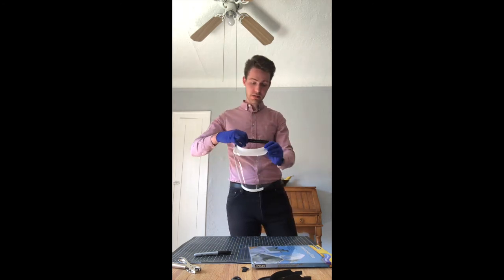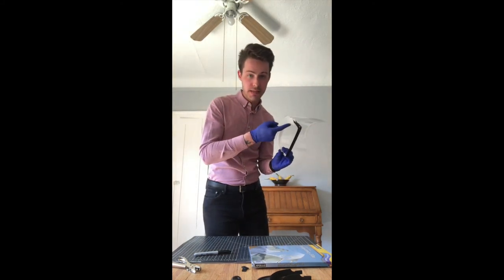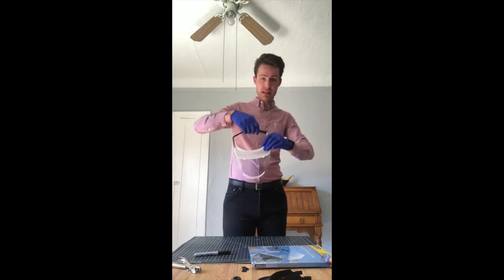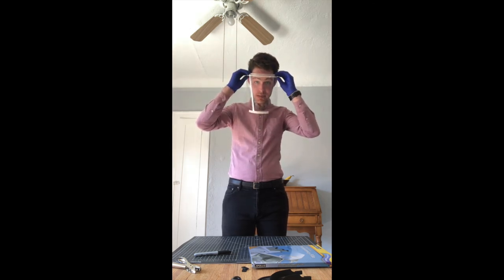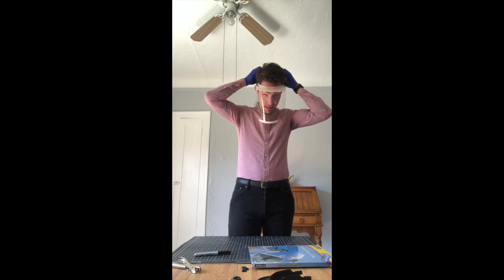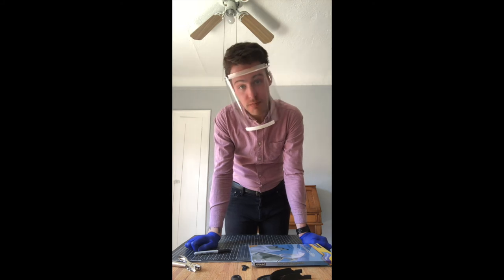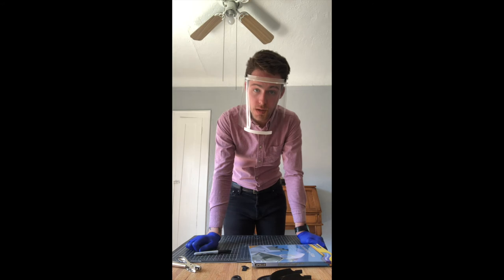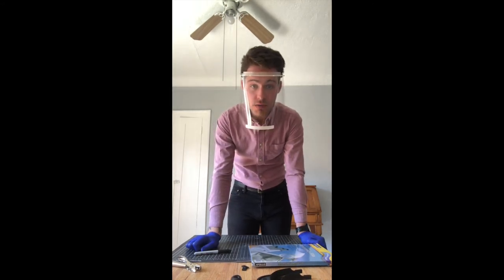And there we have it. Some people apply a small strip of foam to the inside of the visor where it makes contact with the forehead — that's definitely recommended for optimal comfort. However, to bring down the cost and to simplify the assembly process, the partners that I am working with have opted out of the foam component. There are many different ways that you can do this, but that's the long and the short of it.